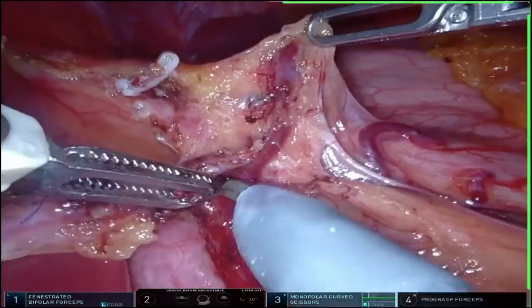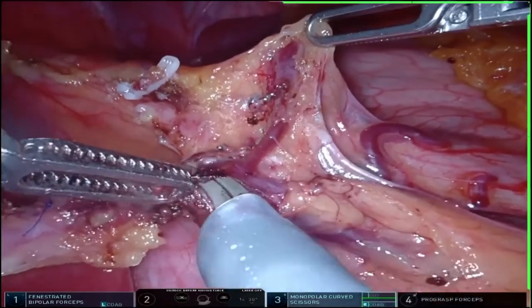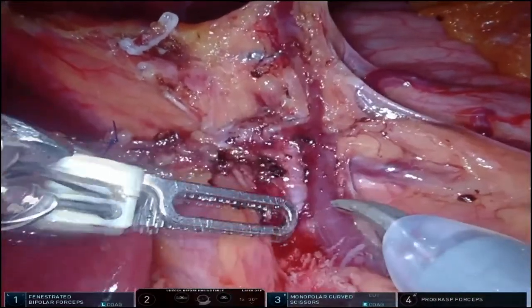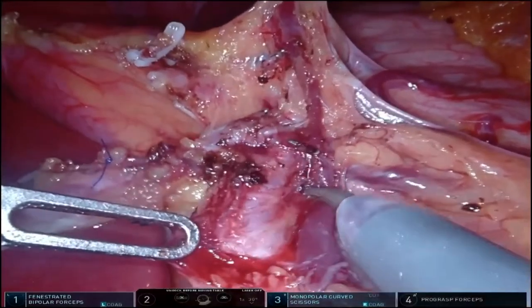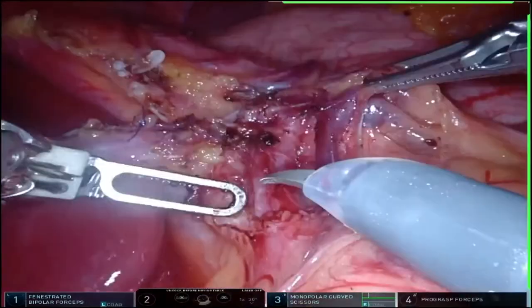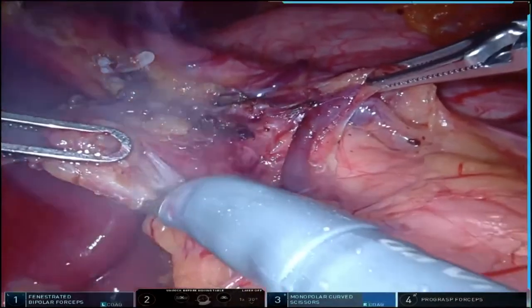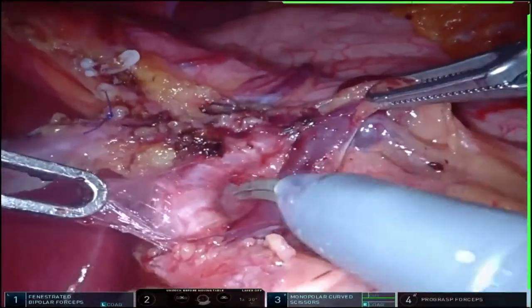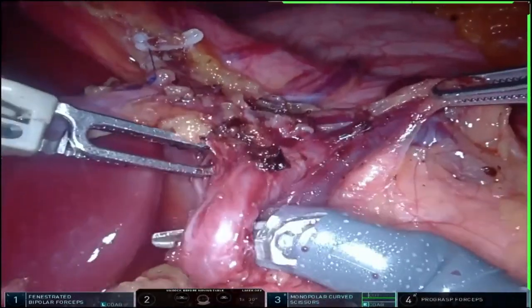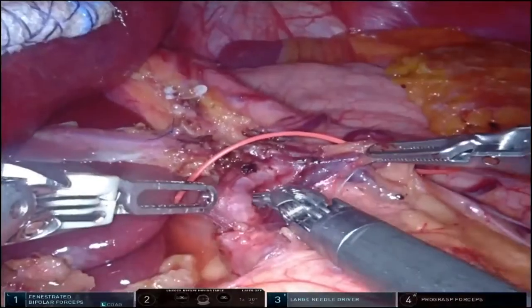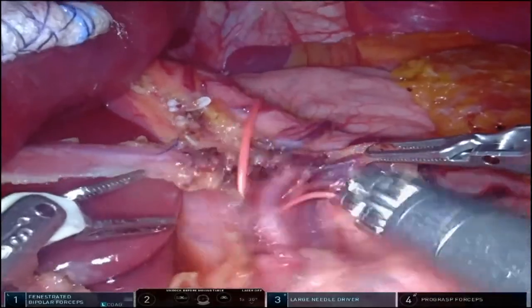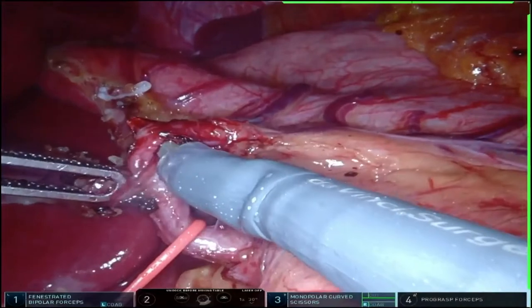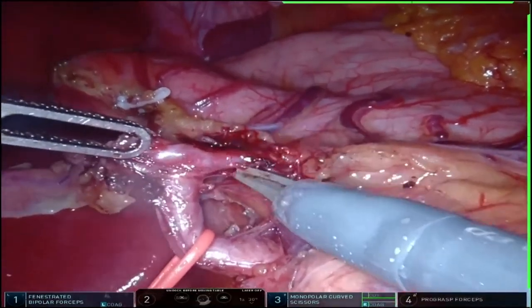These are all branches to the stomach. And now you see the vein — how easily you can separate the vein from the artery and push it away. There's just one more large left branch to the stomach, and once that's taken, the left hepatic artery is free.